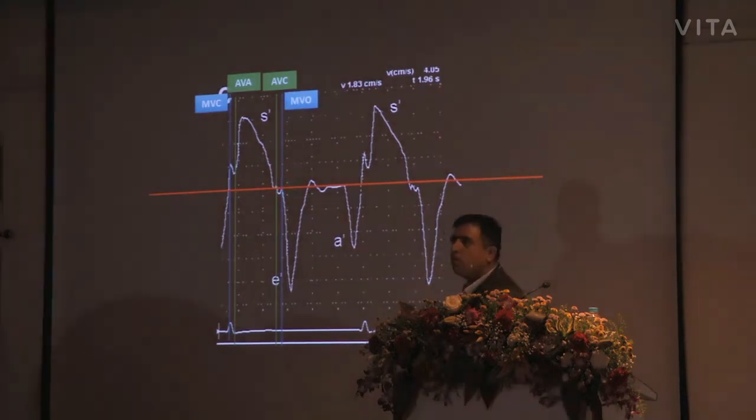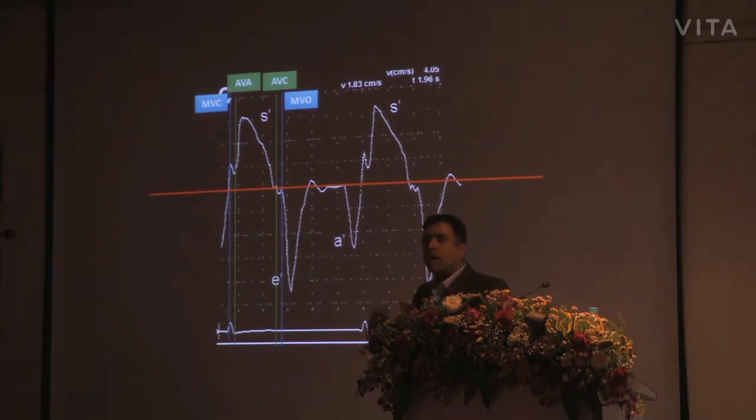And I also mark my mitral valve opening at that location. So this is how you could mark it manually. You don't need to do this, but you need to know how to do it, because you need explanations. What is that positive? What is that negative? If you don't know what you're seeing, you will tend to become more and more confused. The machine will mark this for you automatically, and then you can also interpret it a lot better. Of course, here, as you know, is where the mitral valve closes.